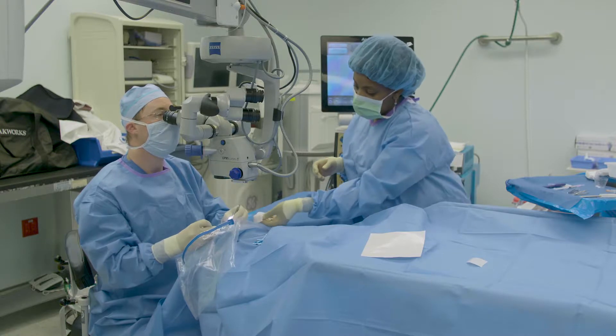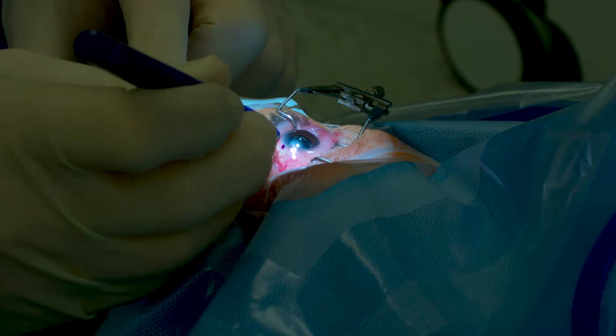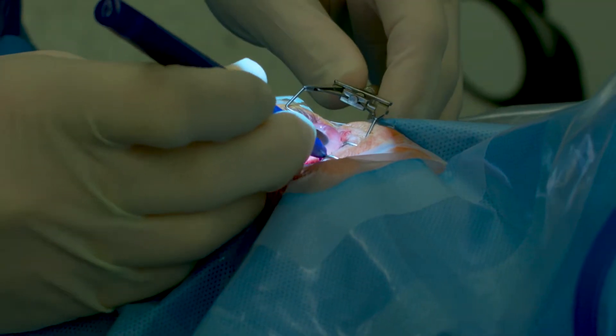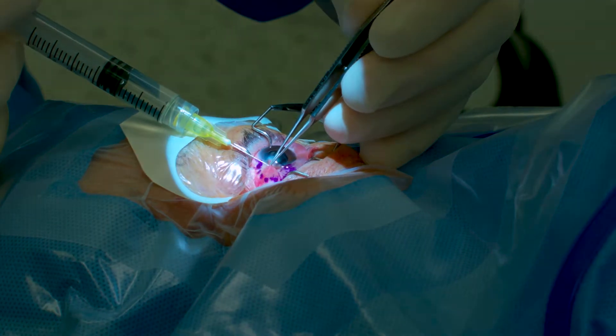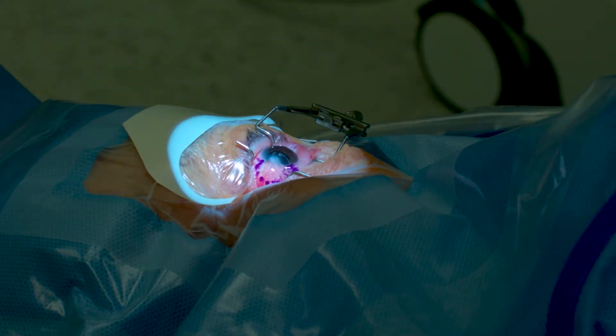The key to excising any conjunctival growth — a pterygium — is to first mark off the peripheral aspect, assess whether you're going to start with your excision at the leading anterior head of the pterygium, which is the part that extends over the cornea, versus peripherally, which is the wing-shaped growth involving the conjunctival tissue. It's really just a feel — sometimes I don't even know until I'm actually touching the tissue to decide what will give the patient the best result.